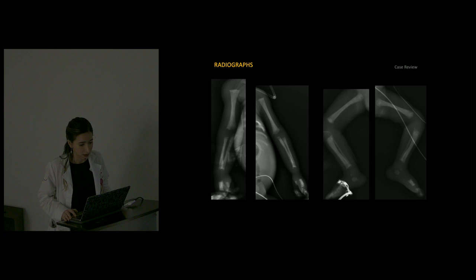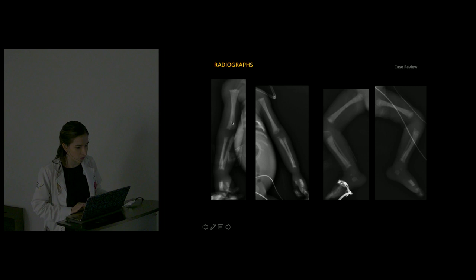We are visualizing a frontal radiograph of the extremities. The examination is limited as no true frontal view was performed, secondary to the patient position. We can see periostitis involving the diaphysis and metaphysis of both humeri, radii, ulnae, both femurs, and tibiae and fibulae. There is also lucency along the metaphyseal region of all the long bones, consistent with the provided history of a positive VDRL test.